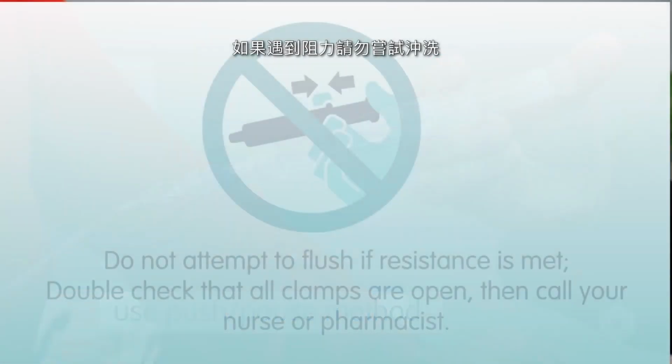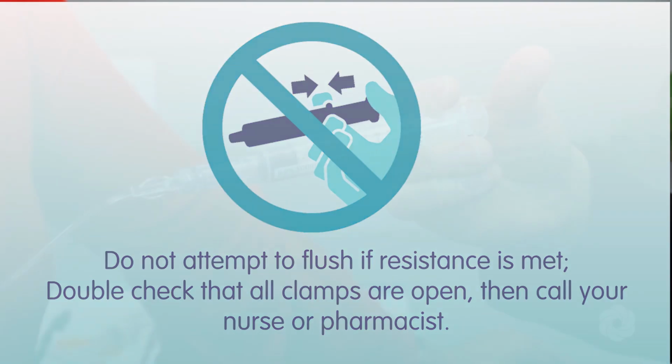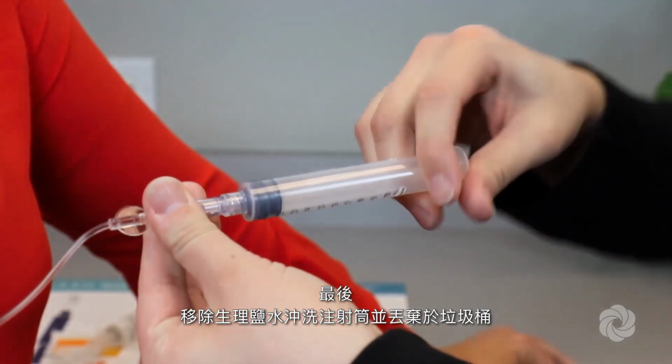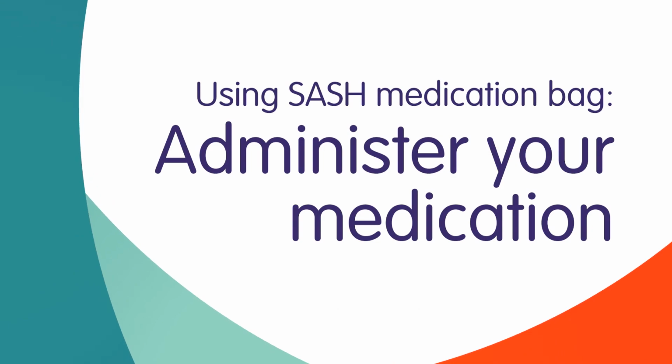Do not attempt to flush if resistance is met. Double check that all clamps are open, then call your nurse or pharmacist. Lastly, remove and discard the saline flush syringe in a trash container. You are now prepared to administer your medication.